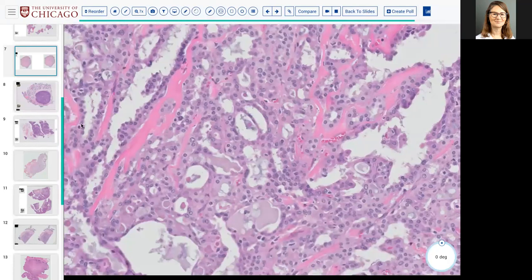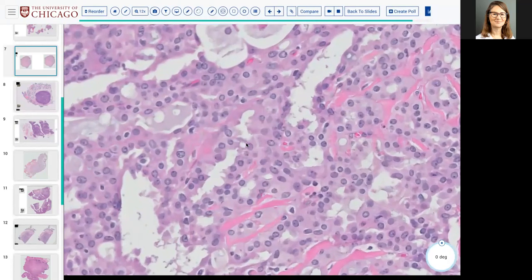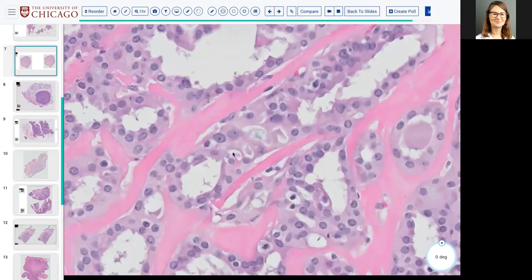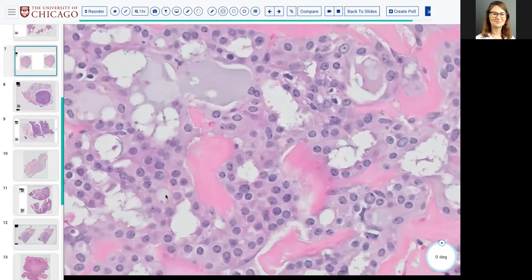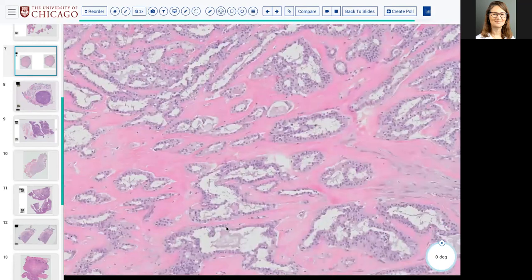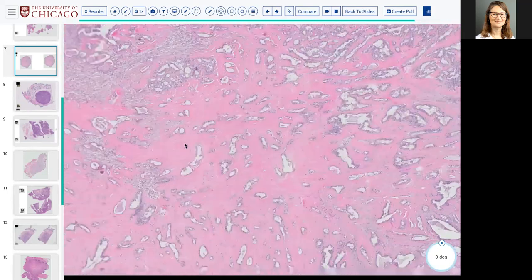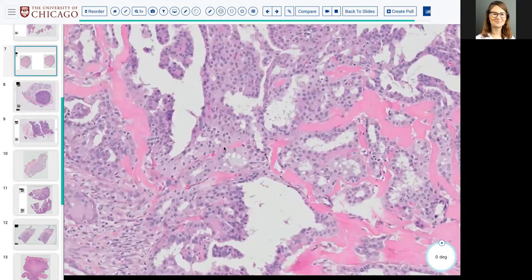Unfortunately, I don't have a mucin or PAS stain on this exact case, but if you're looking for this to be intracellular mucin and you do a mucicarmine or a PAS diastase on this case, one will find that this is not staining, right? So these little vacuoles in the cells are not true mucin, but some other watery kind of secretory material. But secretion and mucin can be very challenging to differentiate, especially on H&E if you don't have those stains. Thing two, so mucin versus absence of mucin for mucoep. And then what else might differentiate mucoep from what this ultimately ends up being, which I think people have already put in the comments.